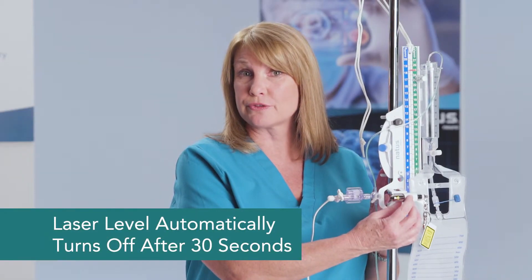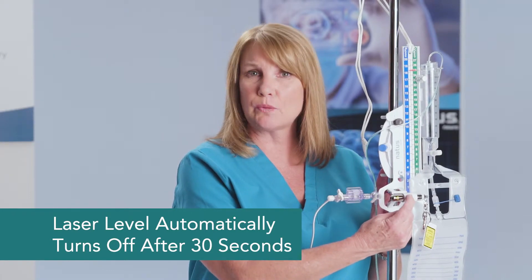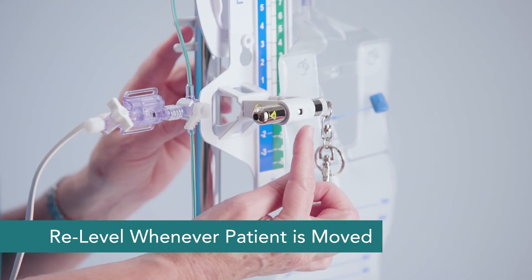Once your patient is positioned appropriately and you have them leveled, the laser level will shut itself off after 30 seconds, or you can compress the button again to turn your laser level off. Just remember that this leveling process is important in order to have accurate intracranial pressure readings and also to drain the patient appropriately. So anytime the patient is moved, you'll need to re-level using your laser level.